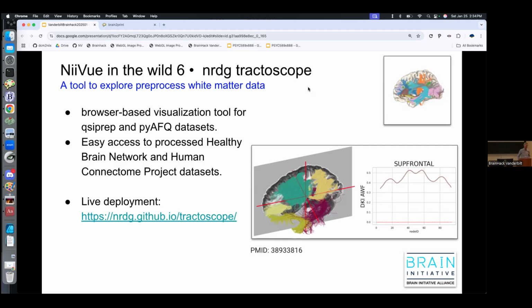So you can choose how you want to do that, right? Obviously with the Python, you could do it through NiiVue, so you can give it your data directly through Python. You can have a backend that will serve everything if you want things to run on the cloud, or if you want it to be on the edge where all the data stays on the user's computer, then you just have the user drag and drop the images and it will handle them. So it's your choice of what problem you need to solve, and then it will fit there. Its job is simply to be the visualization. You can choose whatever kind of wrapper you want to give the user, in a way to solve the problem they have. Okay, thank you.